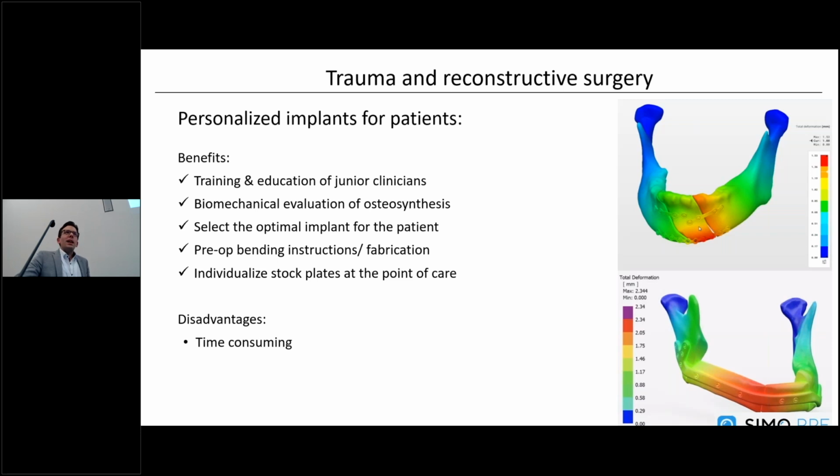I did 3D planning, IPS CaseDesigner, once when I was in the university hospital. It's nice, yes, it's learning. And as a young resident, we get used to it, but it's time consuming. And if you're in private practice, you have your whole day full of patients, you have to do it in the evening. And there are no software developers or planners available after 7 p.m. And of course, it has to be cost effective.